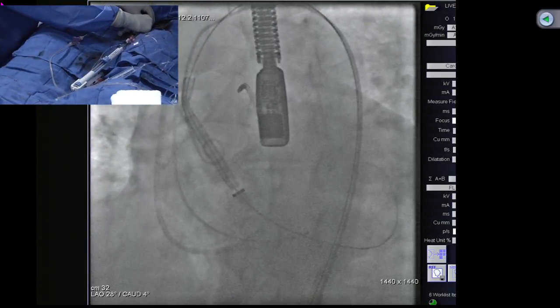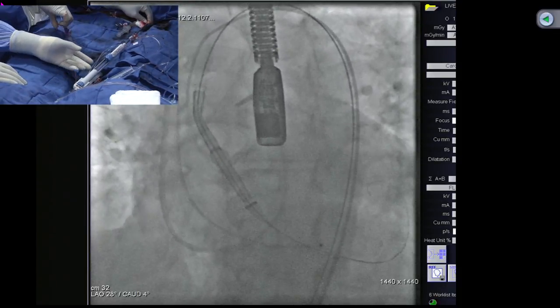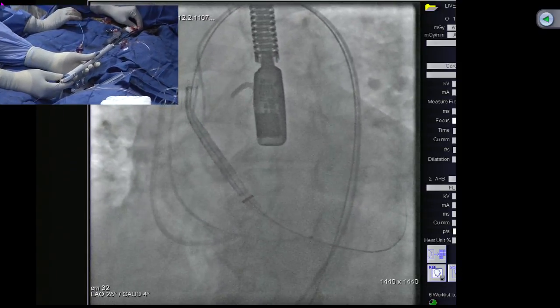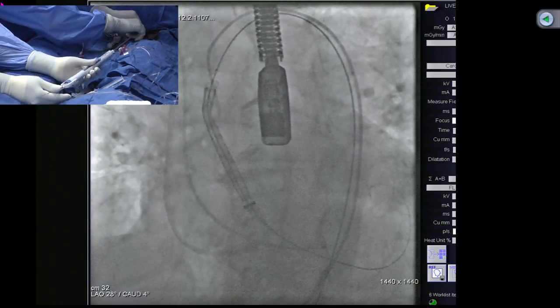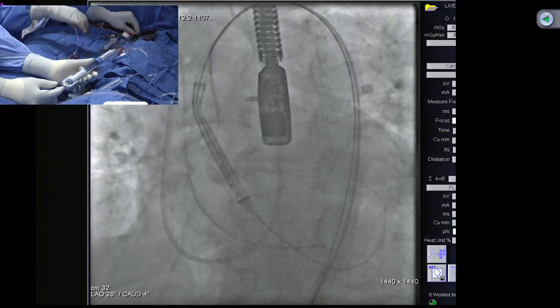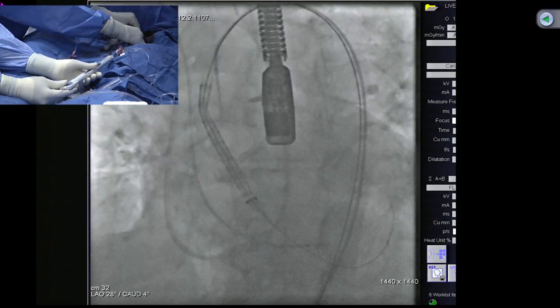It doesn't go down. That's all it stays. It won't go down. Yeah, there's a huge calcium there. Okay, so keep going step by step with what you're doing. Now we have to reorient the pigtail to go to the non-coronary cusp. But I think there's a chunk of calcium. That's all we can get the pigtail to, right? Yeah. Now we go cine.